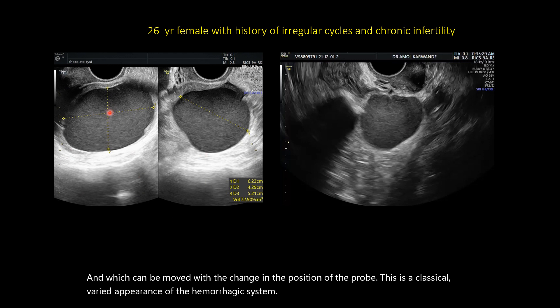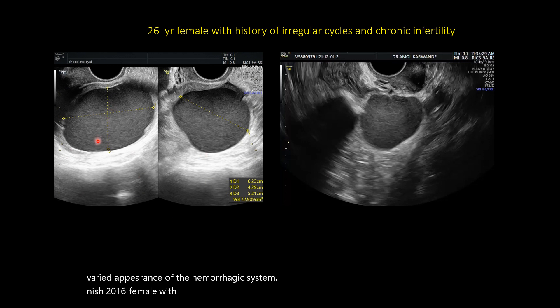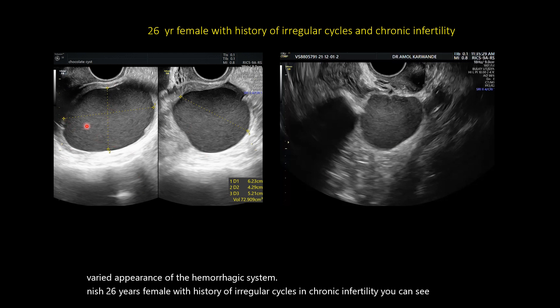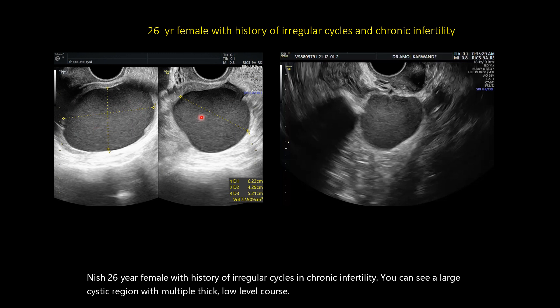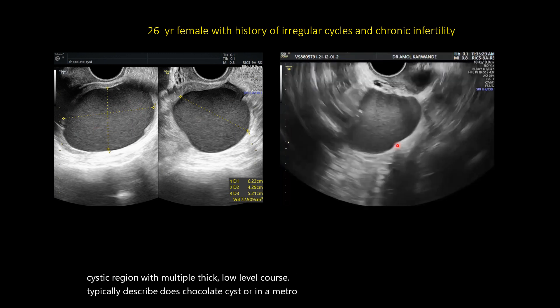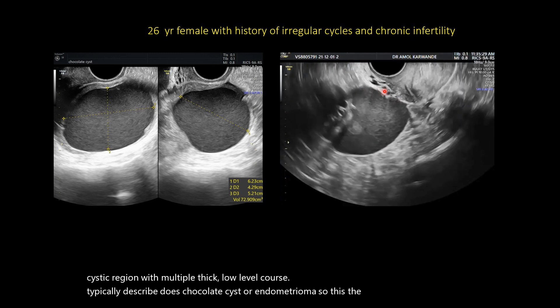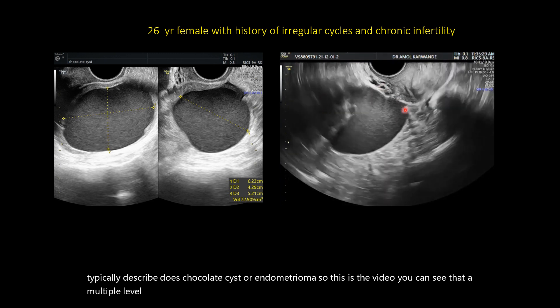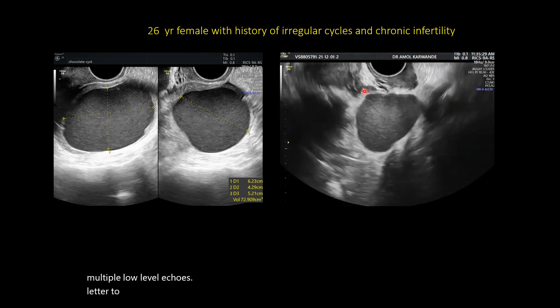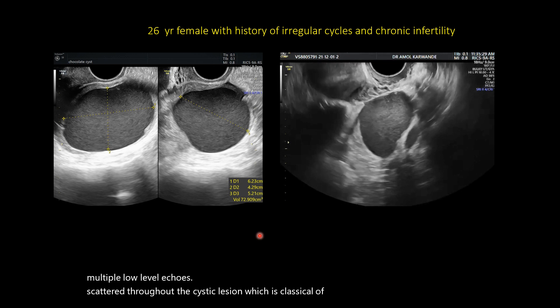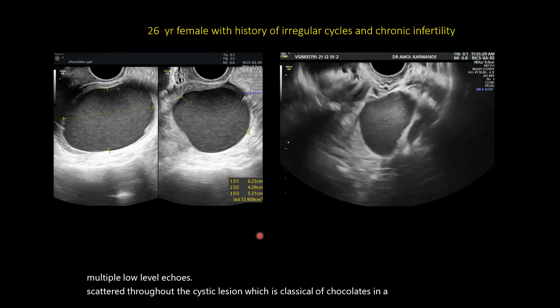Next case: 26-year female with issue of irregular cycles and chronic infertility. You can see a large cystic lesion with multiple thick low-level echoes, typically described as chocolate cysts or endometrioma. There are multiple low-level echoes scattered throughout the cystic lesion, which is classical of chocolate cysts or endometriotic cysts.